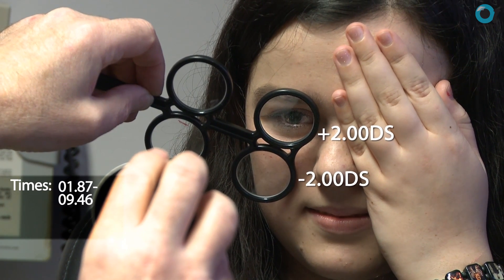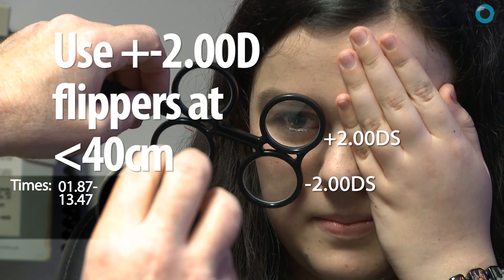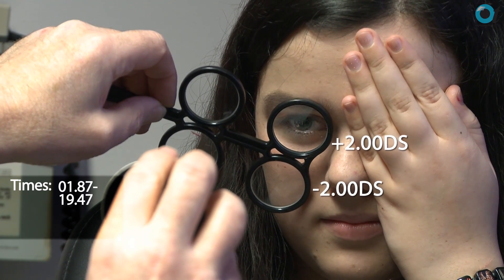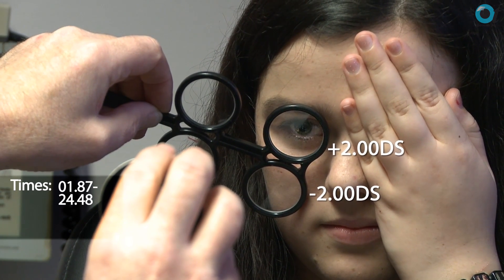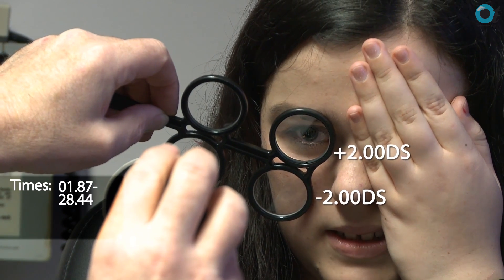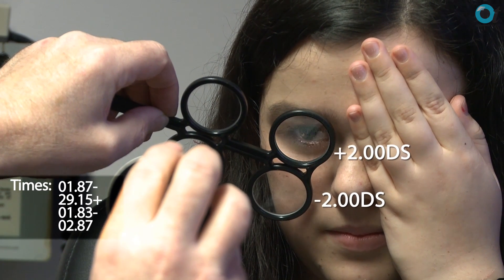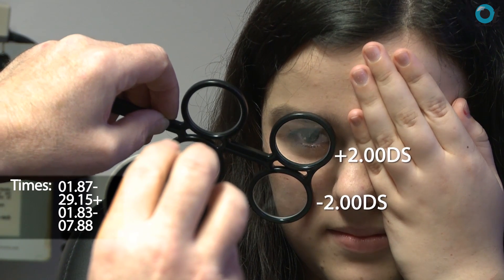The standard test uses a set of lenses on a stick — on one side a pair of minus two lenses, and on the other a pair of plus two. You first test this in good light, done monocularly, asking the patient to tell you when an N5 print is completely clear. Once they can do that through the minus two lenses, you know they've stimulated two diopters of accommodation.